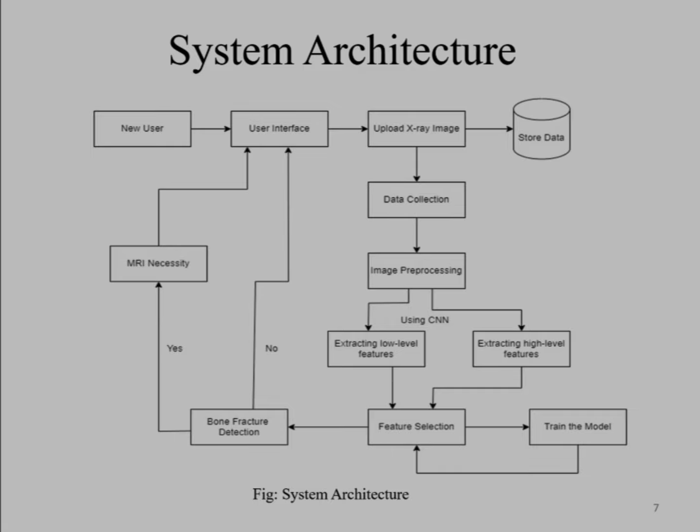MRI necessity recommendation. Finally, based on the fracture analysis, the system decides if an MRI is necessary. If yes, it recommends the patient undergo an MRI for deeper investigation. If no, it concludes that additional imaging is not required.